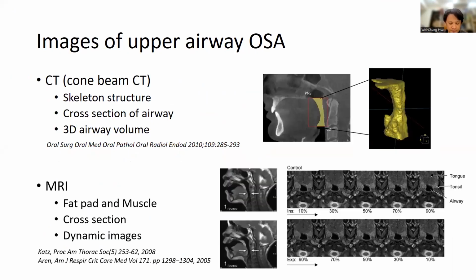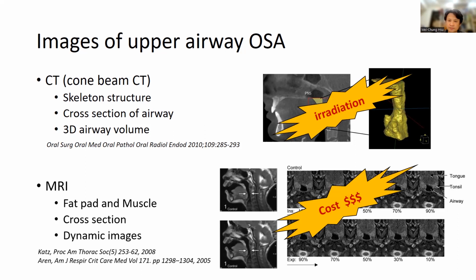However, as sleep surgeons, we are always eager to know more about what the upper airway structure looks like before surgical intervention. Therefore, traditional CT scan or combined CT and MRI were utilized as tools of option to see more detailed structures of both soft tissue and bony structures in OSA patients. But in children, these imaging modalities have disadvantages and shortcomings: radiation exposure, the need for sedation, and high cost.